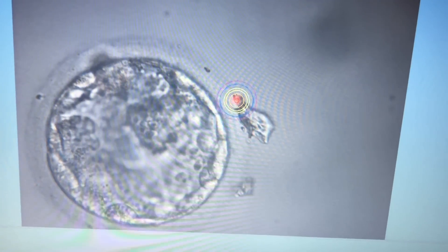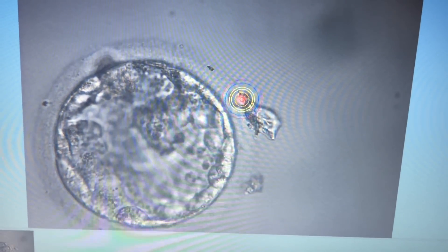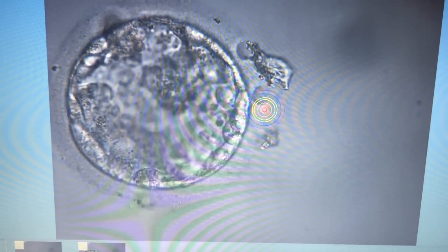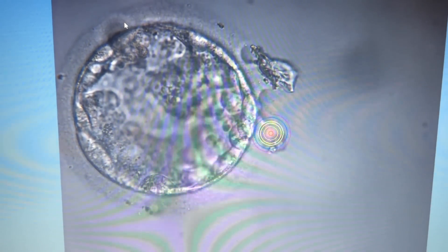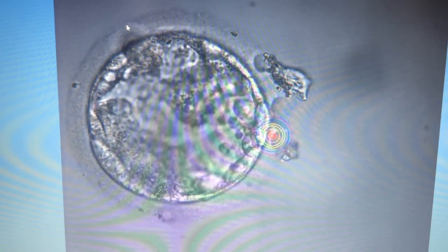Laser-assisted hatching is an important procedure which is performed typically on day 3 embryos. In this video we will be demonstrating the technique on a blastocyst embryo. The typical indications for doing this procedure are age of the lady more than 35 years, frozen embryo transfers, previous failed IVF cycles, FSH values of more than 9 on the second day of the menses, and a thick zona pellucida.